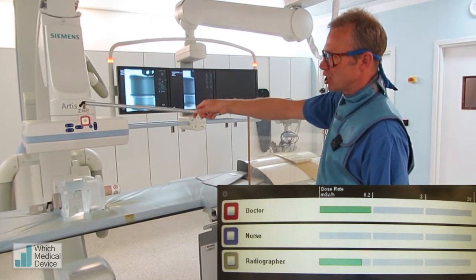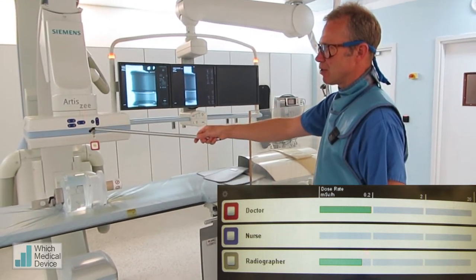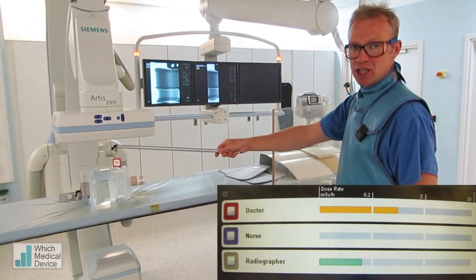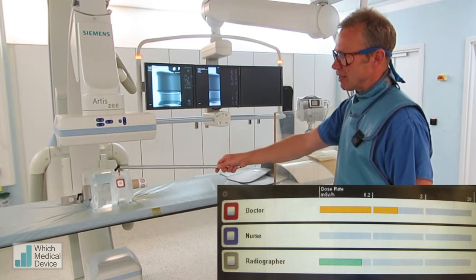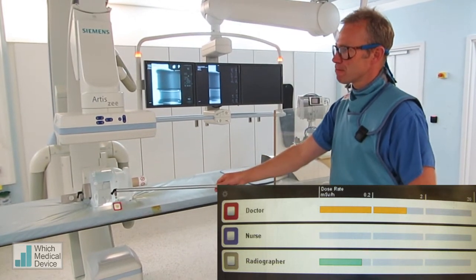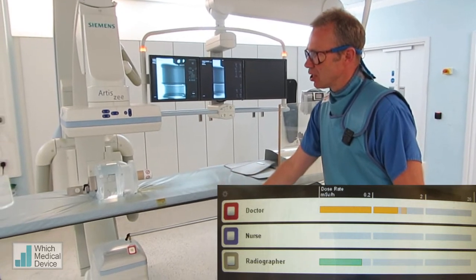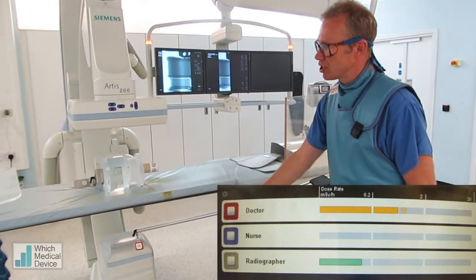Now we're going to lower this badge down and get it a little bit nearer to the phantom we've got set up here. And now we're starting to get more scatter — you see the dose goes up into the orange. I'm going to move it down to about waist height, and down a little bit further towards where your legs will be. And you can see the dose here is still quite significant.